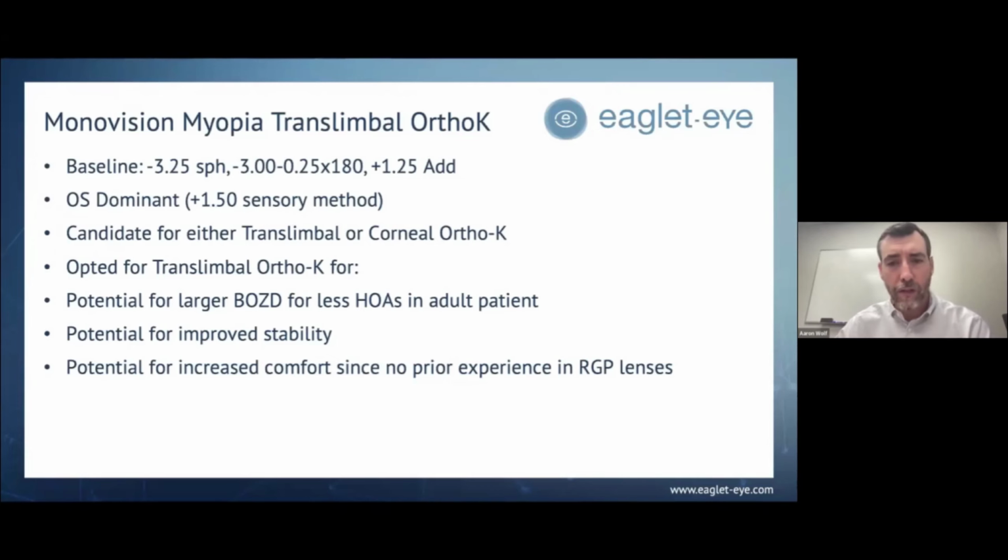And with orthokeratology, the comfort is generally good, but it's not quite as good as a soft lens, of course, right? So we want to try to mimic that as best as we possibly can. The larger size lenses do tend to do that a little bit better. They do tend to be initially a little bit more comfortable, partly because of the centration and the stability.